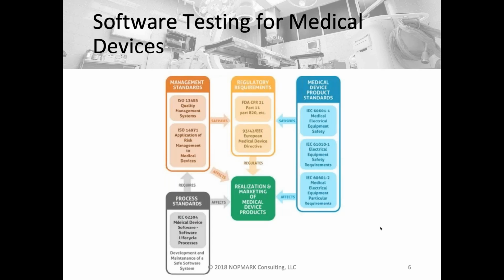The regulations that exist cover a lot of areas. To simplify how someone can look at these standards and regulations and make sense of them, frequently they're broken up into categories that help compartmentalize what's actually required.